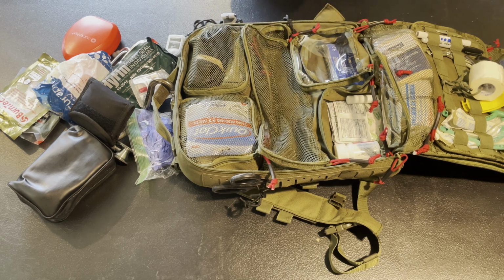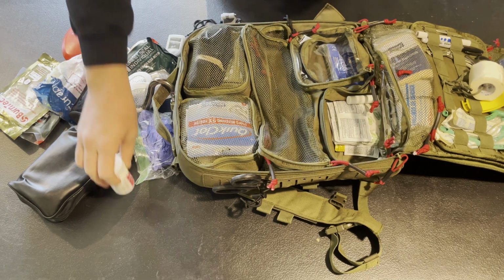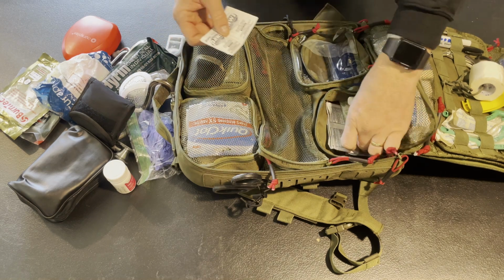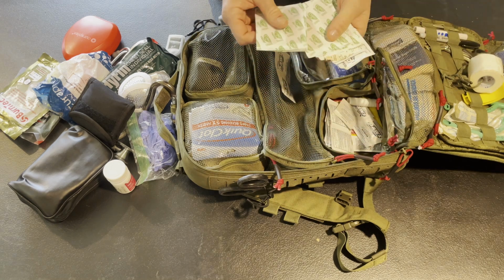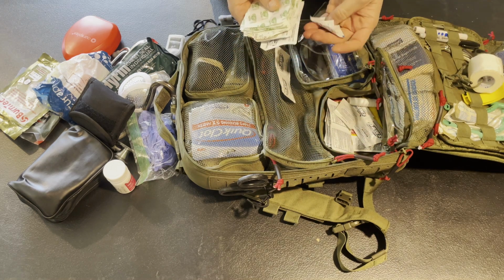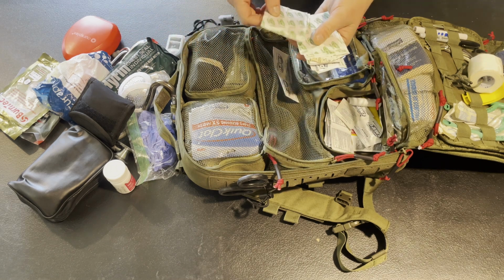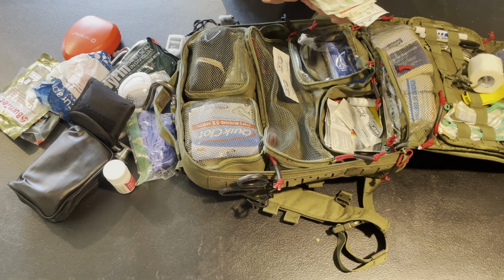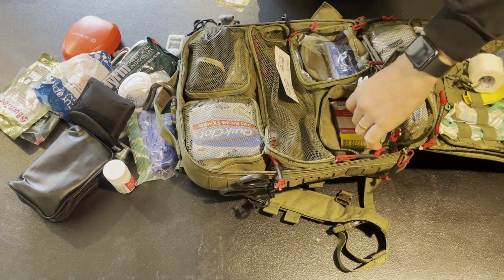And I'm not going to teach you how to be EMTs. All right, so some generic Benadryl for allergies. These are just wet wipes. And this is where I keep all of my Band-Aids. If you're going to be your team medic, it's important to have the big bandaging stuff. But most of the time they're going to say, hey, doc, do you have a Band-Aid? And you can say yes, because I'm not an idiot, and I brought Band-Aids with me, as well as my tourniquets and my Israeli bandages and all that other stuff.